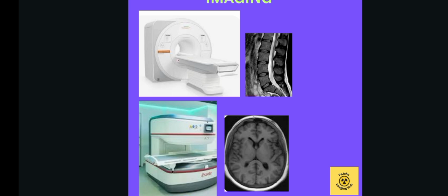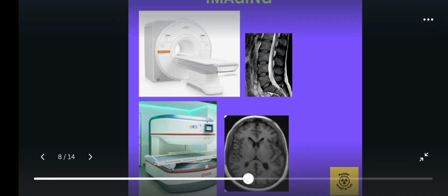I've just shown you the soft tissue. You see the spinal cord. It's able to show the spinal cord very well. Then you see the brain tissues. You can see it well.